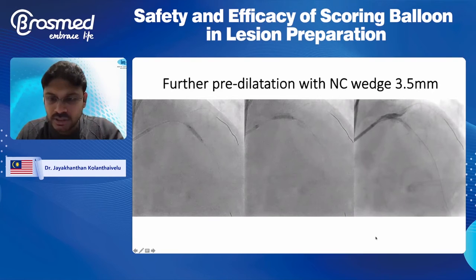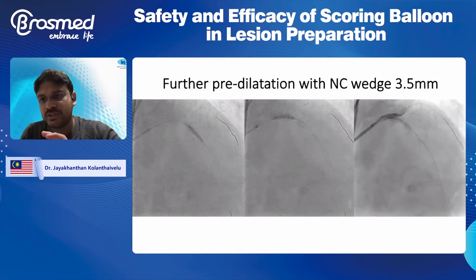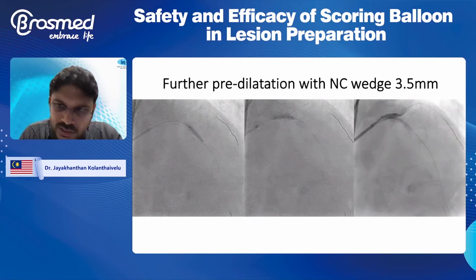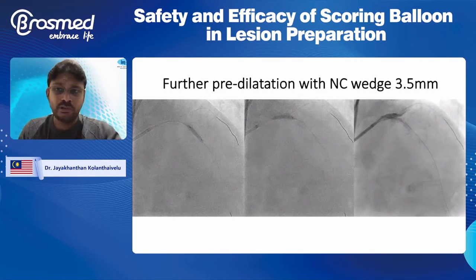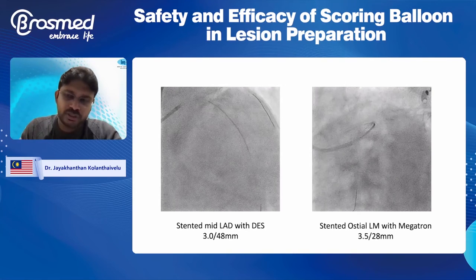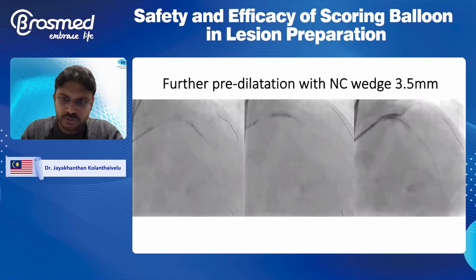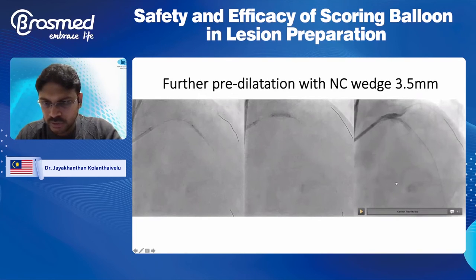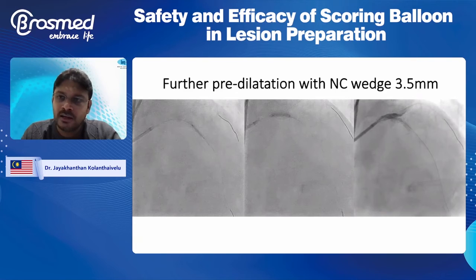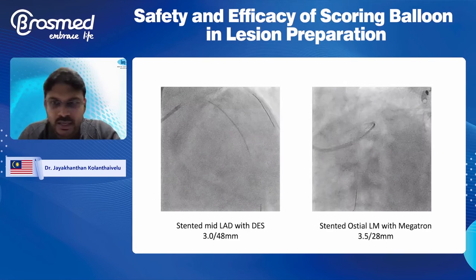It's okay. I mean, that video is a post-dilatation video just to show that we have achieved good pre-dilatation, and we're quite confident that we are able to deliver any stent and achieve very good stent expansion. So, he was a 79-year-old. We debated whether we should put a DCB. That last video would have shown why we were talking about DCB, because we achieved such good results. We didn't see much dissections distally. But then we thought he's a 79-year-old.